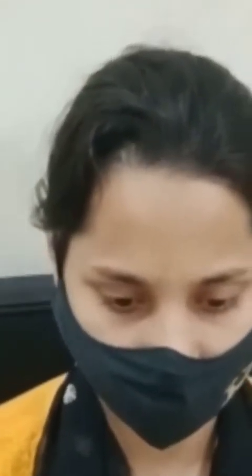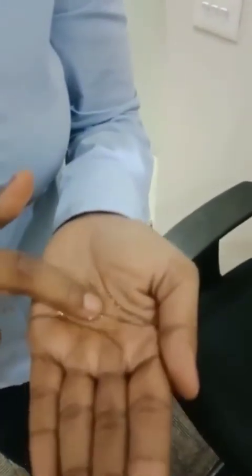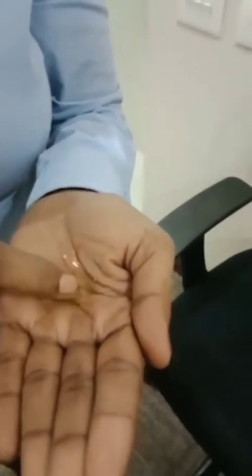Make the patient look up and gently slide down the lens with your index finger and pinch out the lens to remove. Always clean the lenses after removing them from the eye. Do the rub and rinse to clean the lenses and put them back into the lens case.